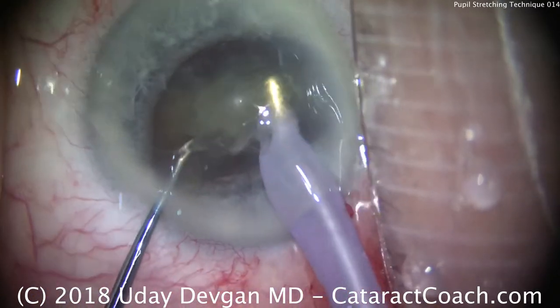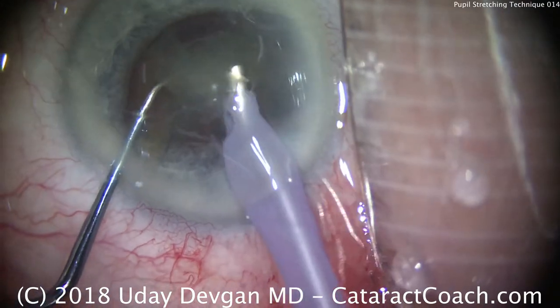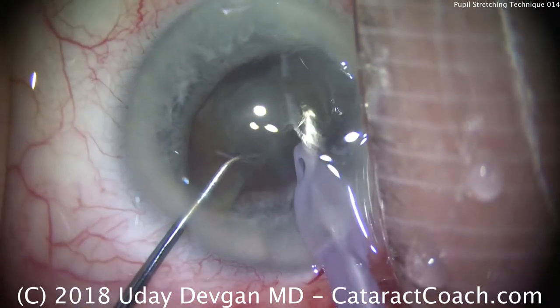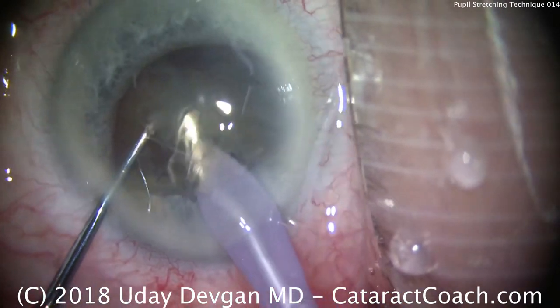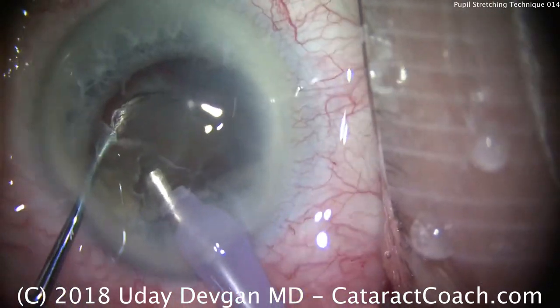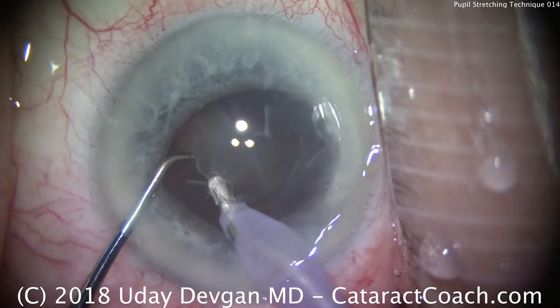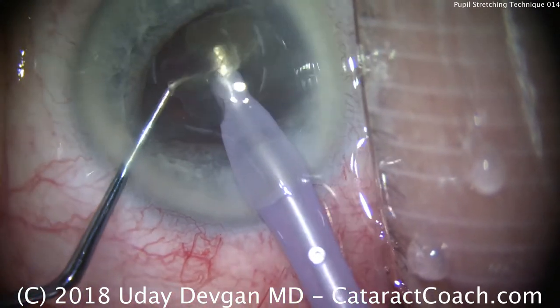Taking our time to emulsify the first half. The phacoprobe is placed at the iris plane, not riding on the corneal endothelium — we try to stay away from the endothelium. We have most of the first half out now. Remove that last piece, and we have about half of the nucleus remaining. Buzz into the other half, bring it up. With high vacuum, the chopper goes around and we can chop off a little piece and take it out of the eye.